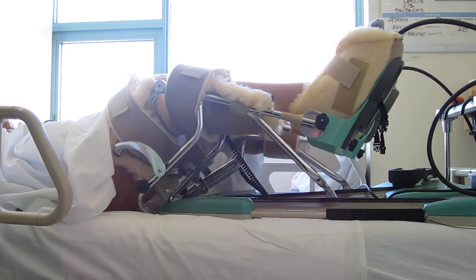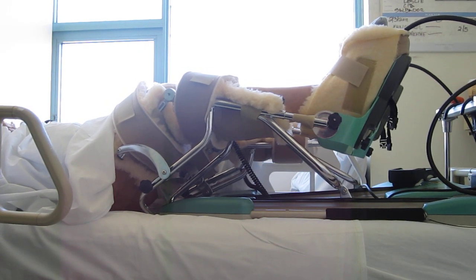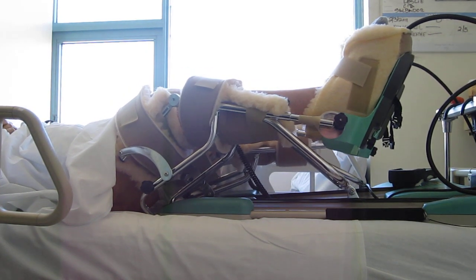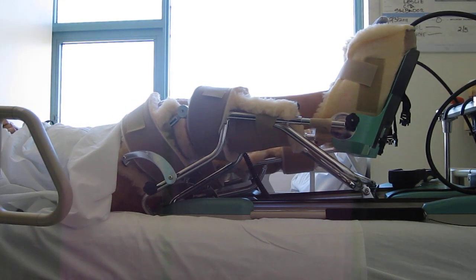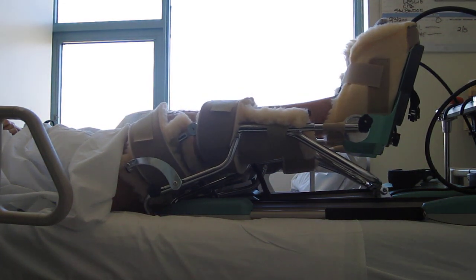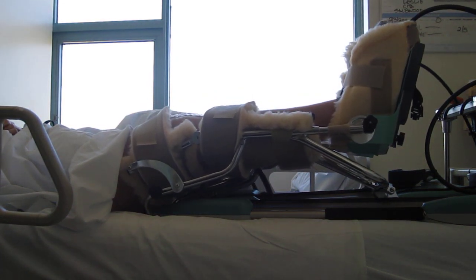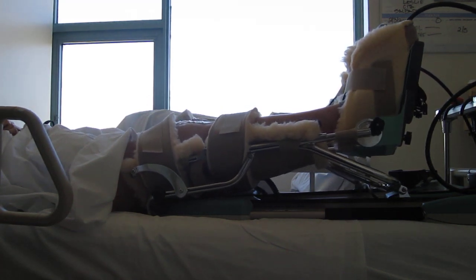The surgery went over very well and the knees are currently in flexion and extension. The machine is on its highest setting at setting number 5, speed level number 5. So this is as fast as the extension and flexion machine goes.